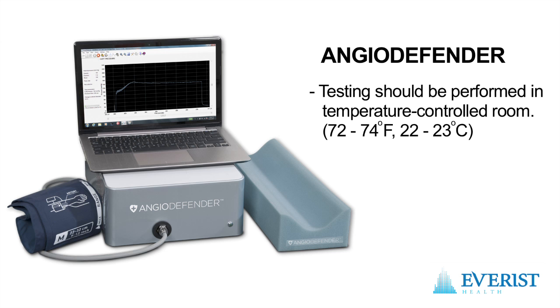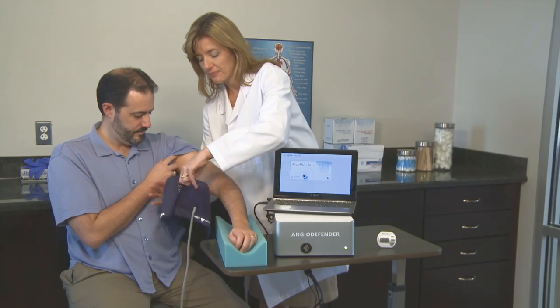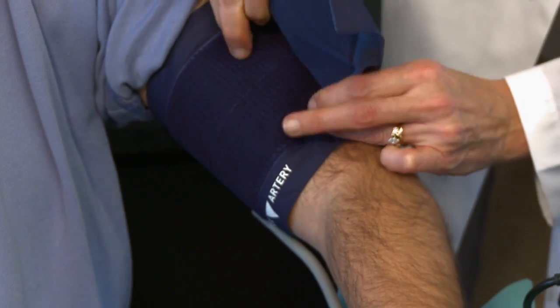To perform testing, a properly sized cuff is first selected for the patient's arm. Place the cuff on the patient's arm above the elbow. Make sure the index artery mark is within the range indicated on the cuff.